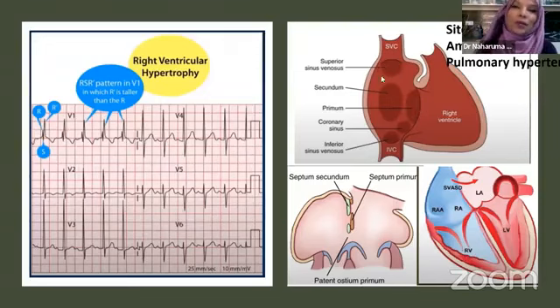And how do we determine the sinus venosus ASD? We know there is a defect in the SVC location. So when there is a defect, the sinus node sometimes is not located in the usual site. It may be towards the left lower quadrant, so it is near the AV node. So sometimes we get abnormal P axis and short PR interval. So the axis of the P and QRS can tell and can classify the ASD.